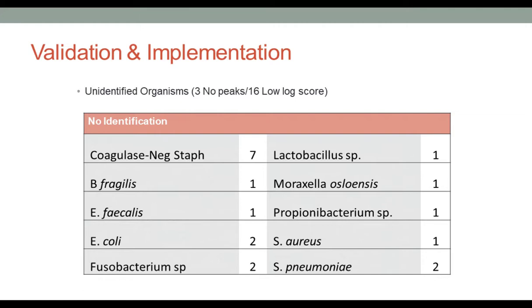Now, it does take a little bit of time. We do 6 batches a day. We do 2 batches of testing on each shift, including third shift, and it takes about 20 minutes to do the process of processing samples. Keep in mind, we do about 5,000 blood cultures a month, and so a lot of times we're processing 10 to 12, 15 samples at a time. And so it takes about 20 minutes to do that processing step, and then we put it on the Multitof.